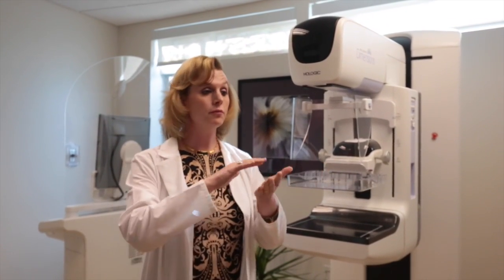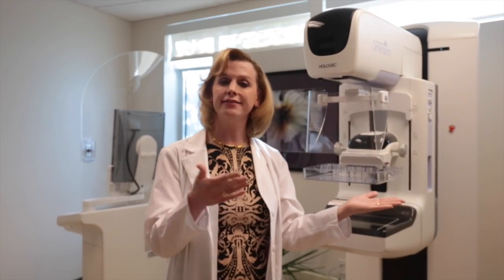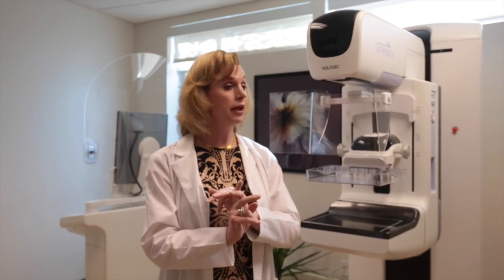With this, many times we don't have to do that anymore. And again, the large places that have had this have found that their callback rates have dropped by almost 20, sometimes 40% from where it was before. So before, we would call back as many as 10% of women. That leads to a lot of anxiety.